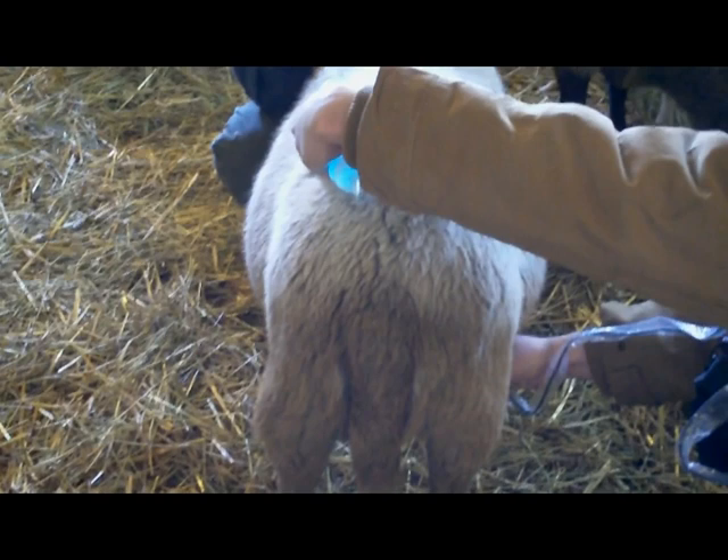If you are unable to get a good image from the right side, you can try the left side. If your ewe has any hair in the flank area where your probe is placed, you will not be able to get a clear image until the hair is removed.